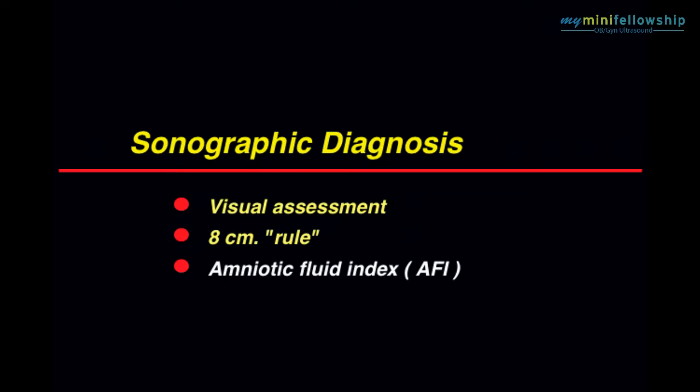That is not true. Nonetheless, there have been very few measurements I've seen in obstetrical sonography that have taken the obstetrical community by storm, more so than the amniotic fluid index. It's almost like it was chiseled on stone tablets next to a burning bush.